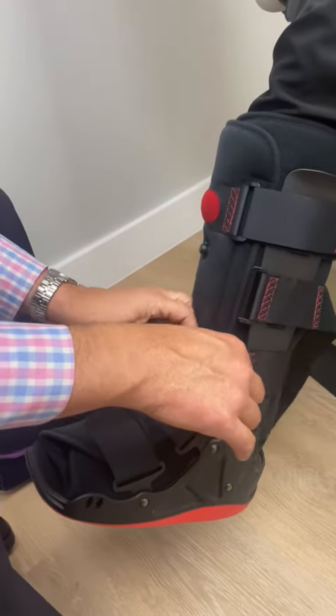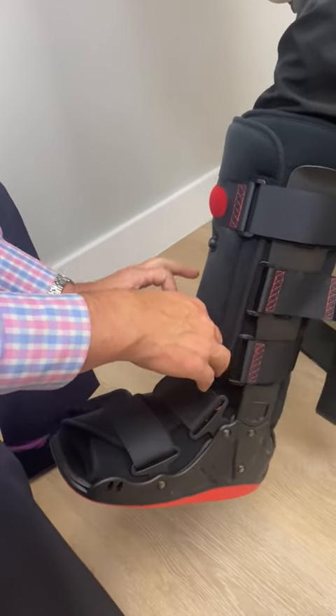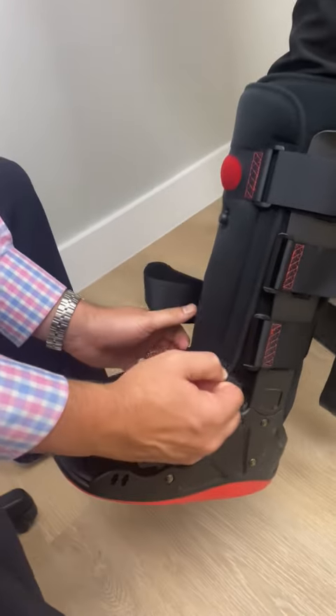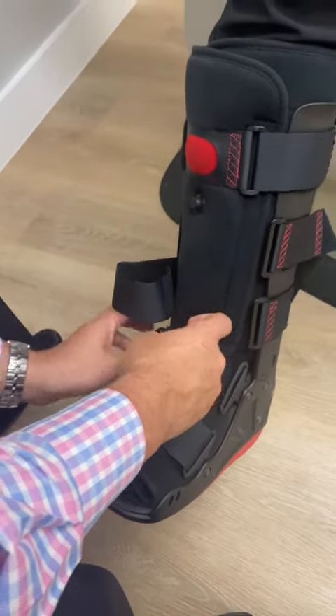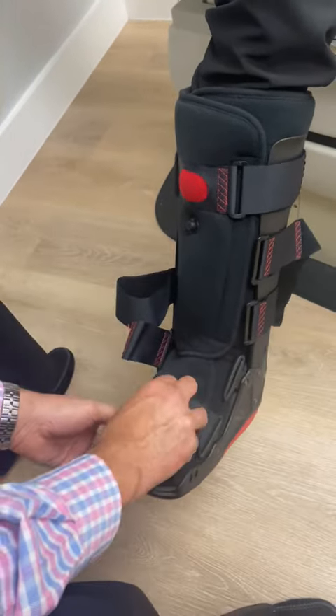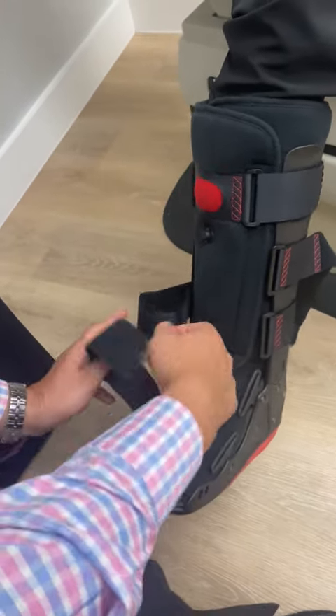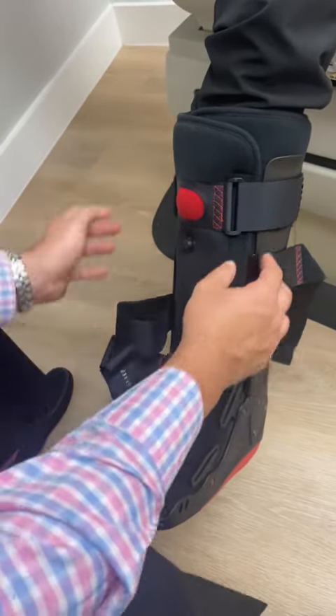Do that all the way down — continue to do it, just keep them nice and out of the way, so that even like this, it will be able to get your foot out nice and easily. Just keep reattaching them so they're out of the way.